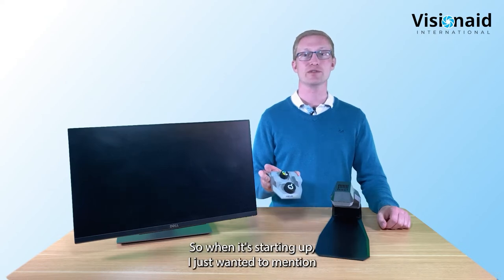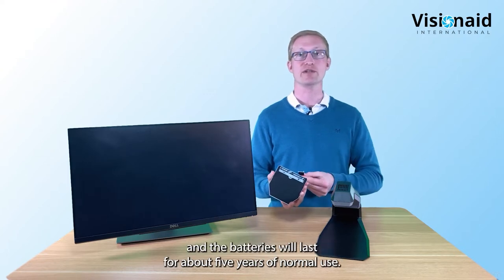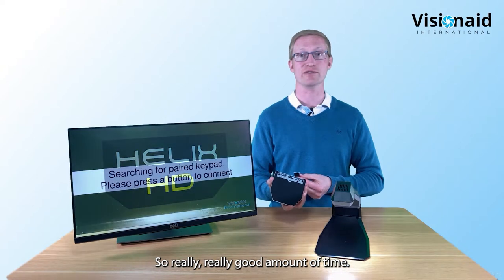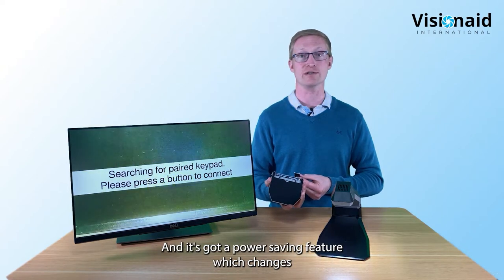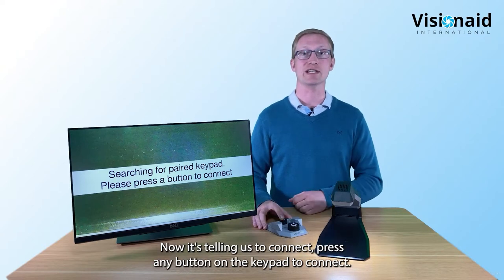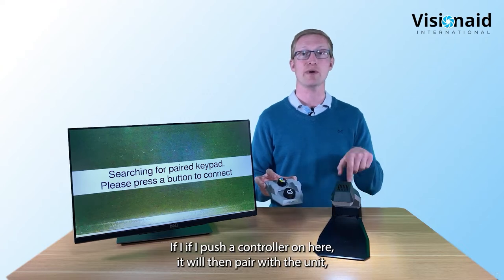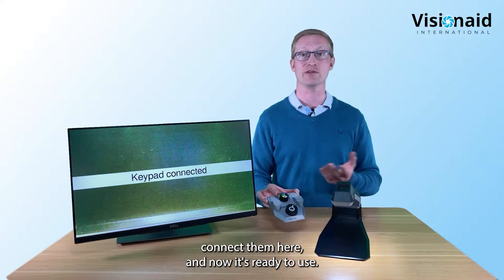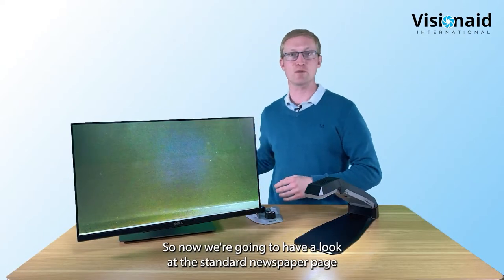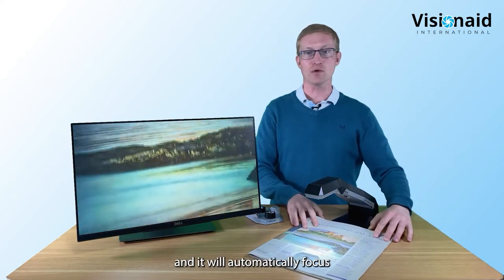The wireless keypad comes with two triple-A batteries that last about five years of normal use - a really good amount of time. It also has a power-saving feature that turns itself off automatically when not in use. The unit prompts you to press any button on the keypad to pair. Now we're going to look at a standard newspaper page under the Helix HD - just pop it underneath and it will automatically focus.